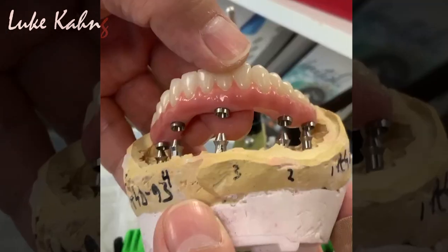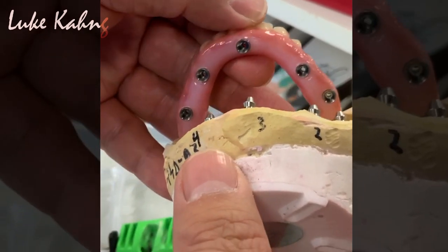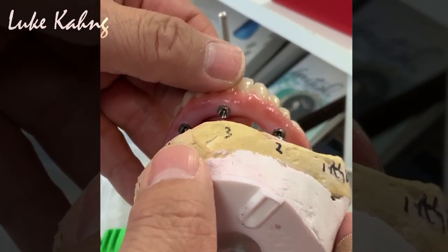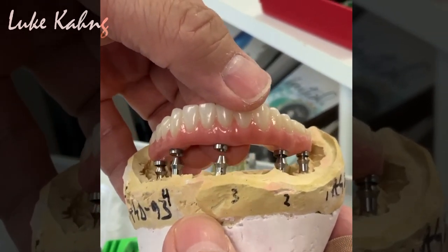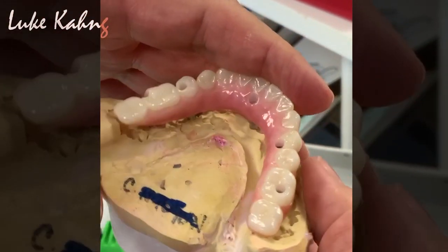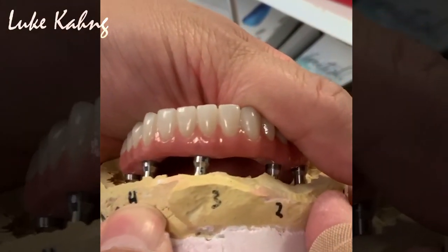Great. This is really good precision. We just put together with a long span, which is monolithic. It's beautifully done, right? No rocking. Everything's mono. The highest aesthetics you can get.